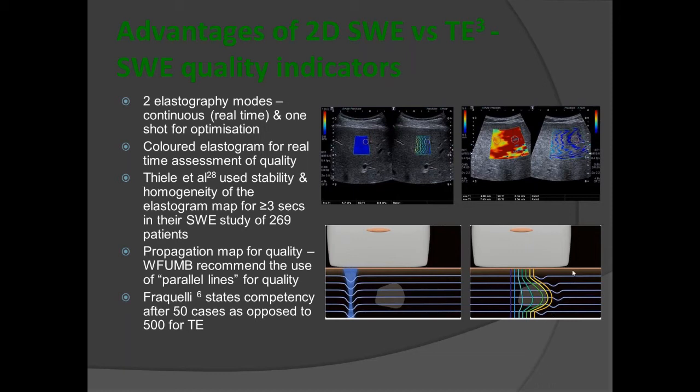But if you think about it, as we can see illustrated in these two images below, when you push your pulse along and it hits an irregular bit of tissue or a stiffened bit of tissue, your lines are going to change because the geometry of what you're sampling changes.